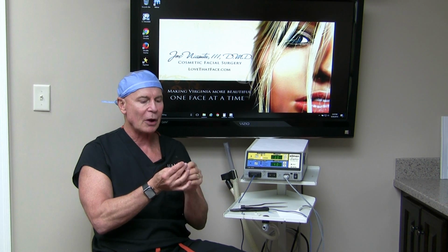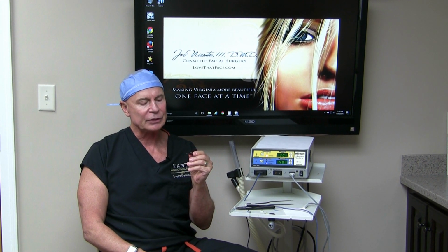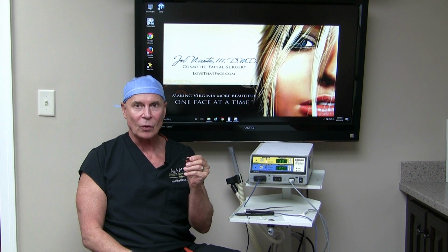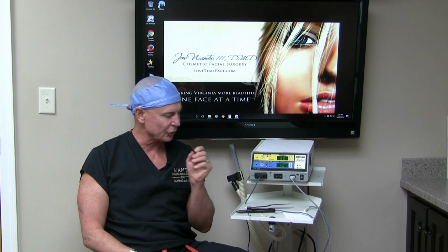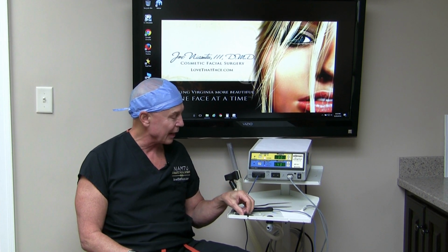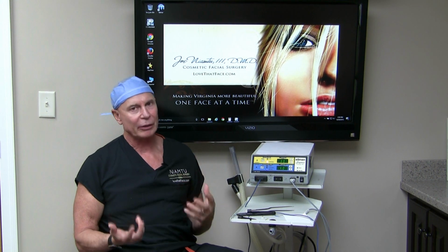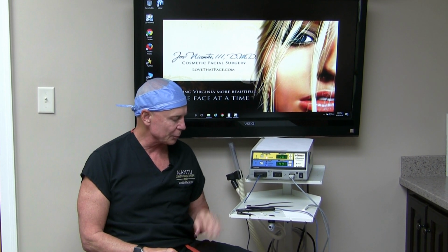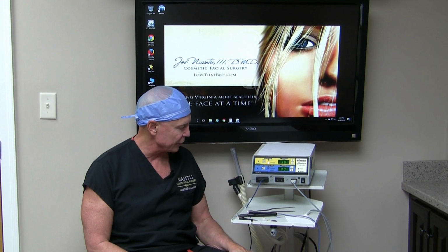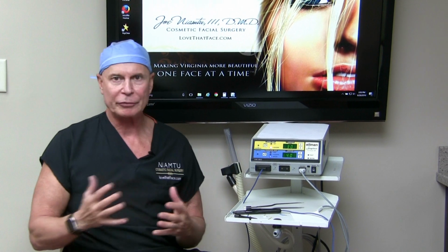And then there's a smaller one, which I use a lot, and I have a lot of videos using this for blepharoplasty or very controlled, fine hemostasis. So you have to have the bipolar. Now, depending on which Ellman unit you have, you could also do Pellevé, which is non-invasive skin tightening. But in terms of surgery, I use this all day, every day.